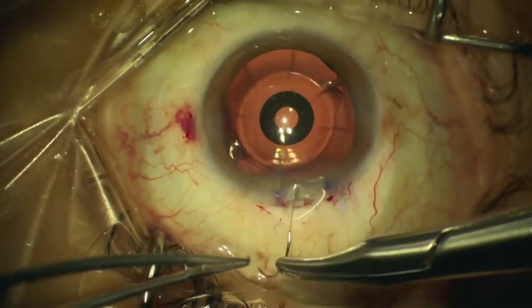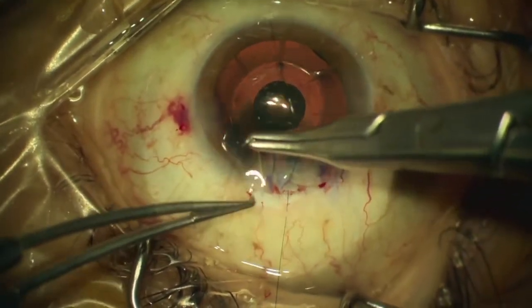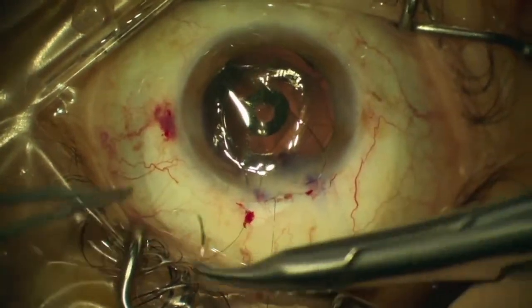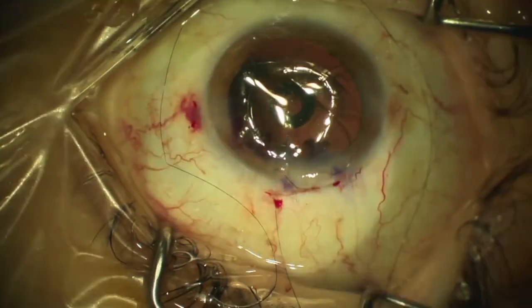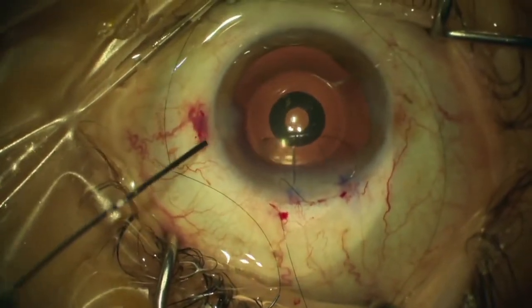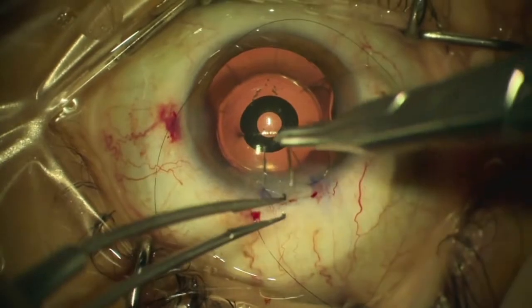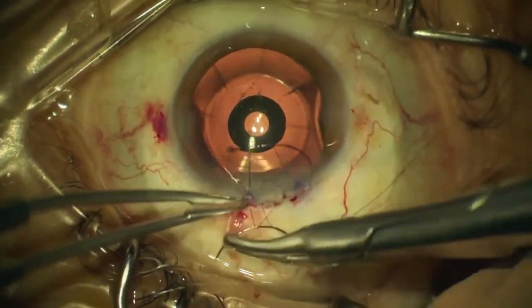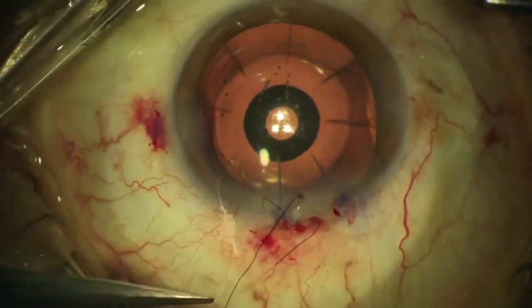A 10-0 prolene suture is used for this purpose. The first stitch is set from inside the outer wound lip to have the knot buried, so we do not have to rotate the crossing suture. The knot is gently tied with the eye under pressure.